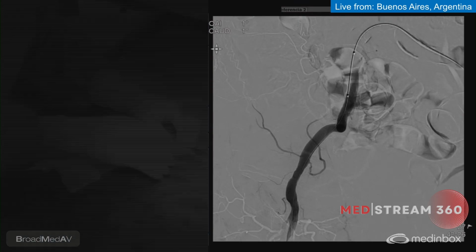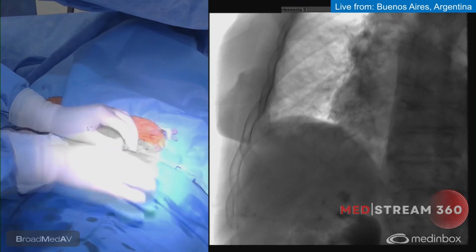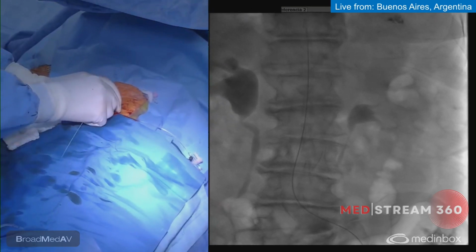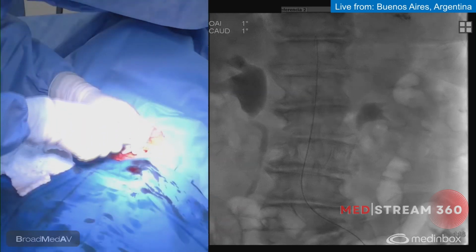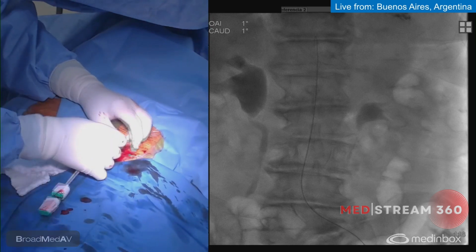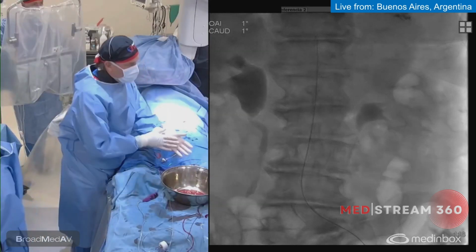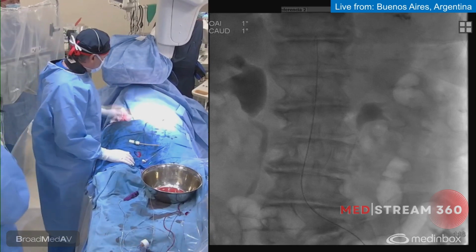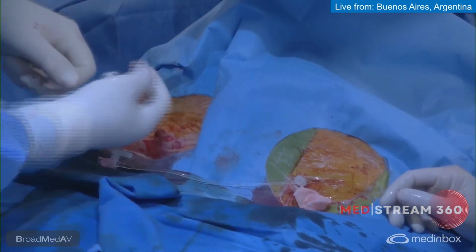Remember, the take-home message of this patient is how to solve a perforation that can occur whenever, always unexpected, sometimes expected. But in this patient with the regular balloon, nominal with the stent, and using nominal pressure, we have a perforation. This patient is going to be in regular follow-up, echo follow-up at 1 month, echo follow-up at 6, and then we will check everything. So we will leave the venous access just in case for a few hours, and then we are done.